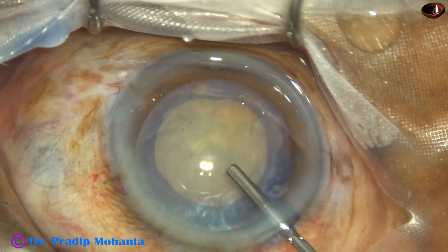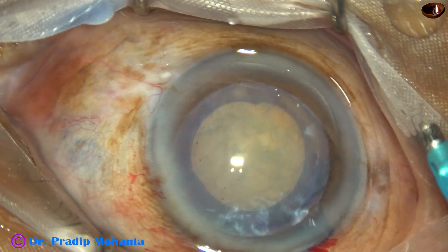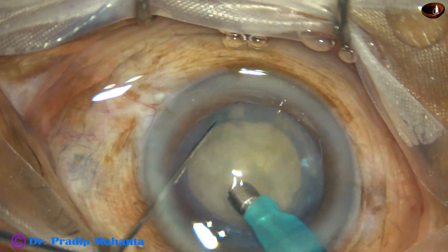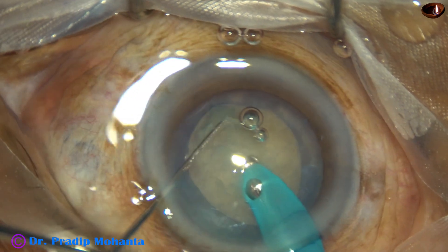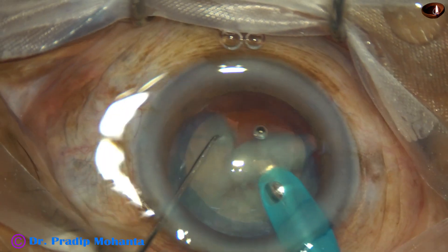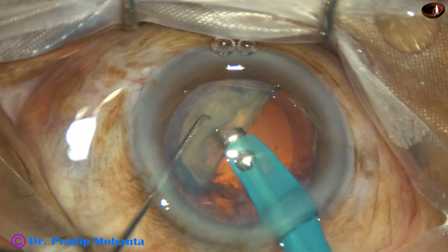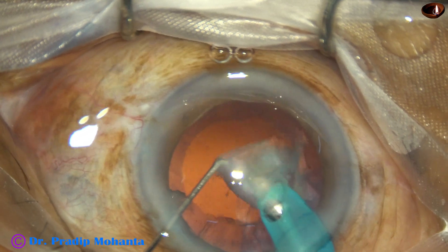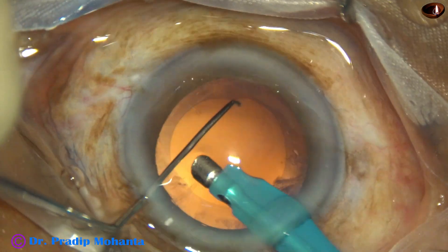And now is the easiest part — nucleus management. This cataract is not very hard, so ultrasonic energy is about 60 percent. Flow rate is 47 ml per minute, and vacuum is 475 millimeters of mercury. This is a brittle nucleus; it could be cracked easily into fragments, and I could emulsify the pieces.